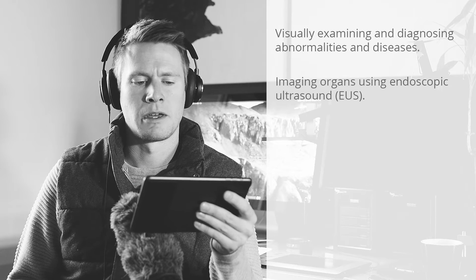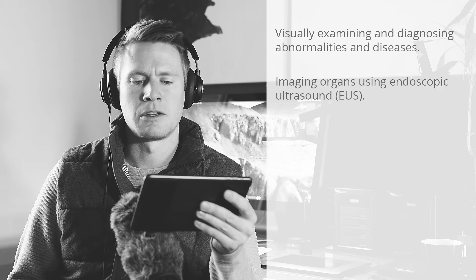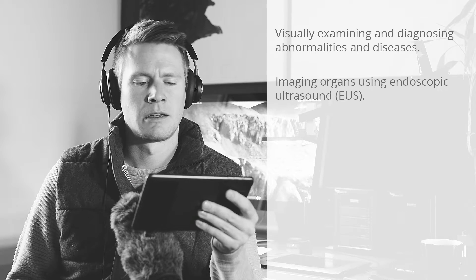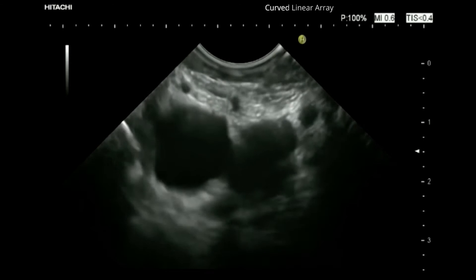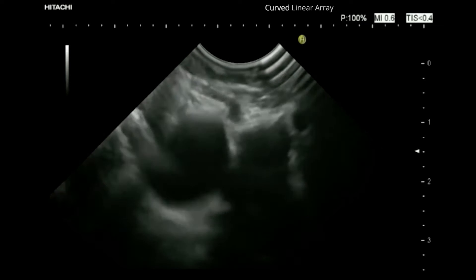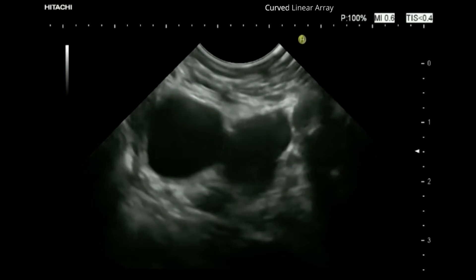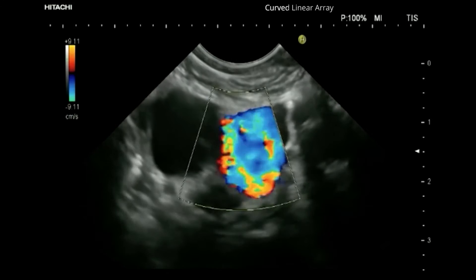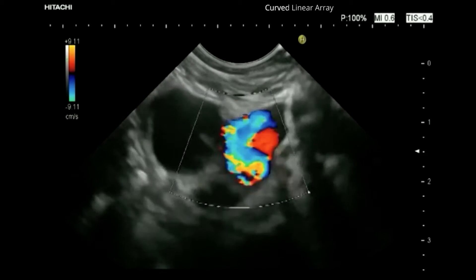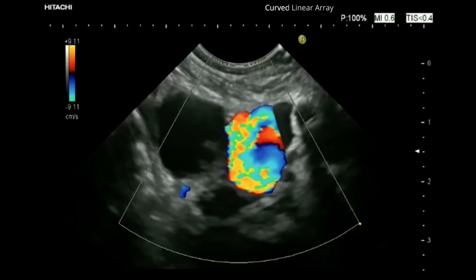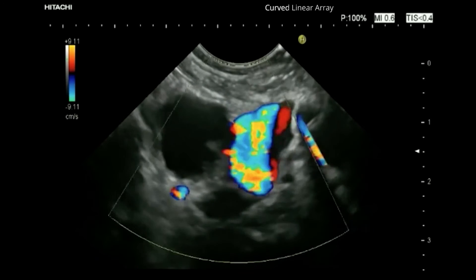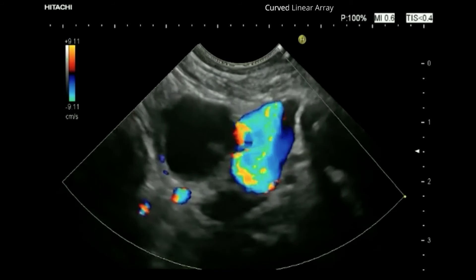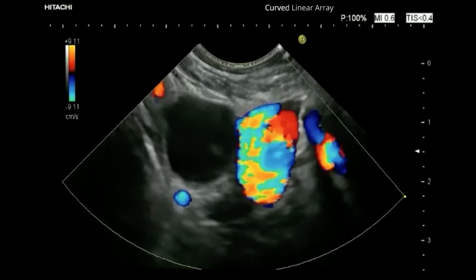Imaging organs within and adjacent to the GI tract using ultrasound. This technique is known as endoscopic ultrasound, EUS, and the endoscopes are often known as echo endoscopes. Endoscopic ultrasound is used to guide many endoscopic therapeutic procedures.